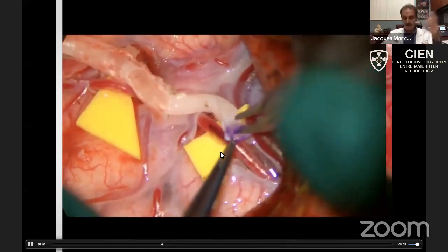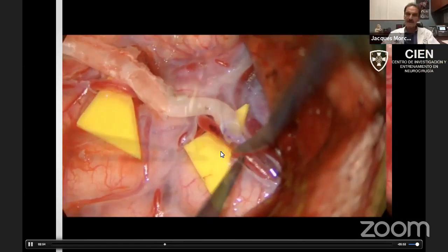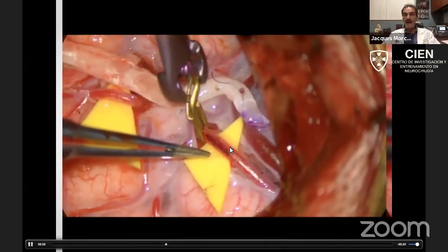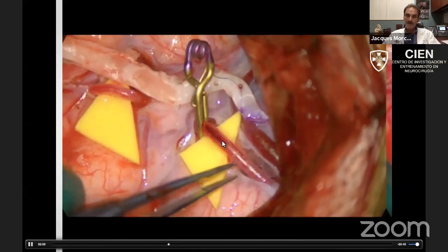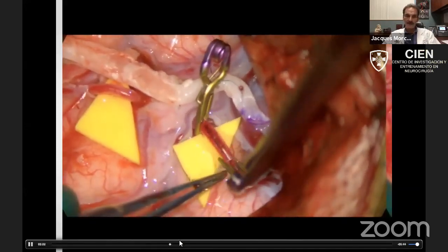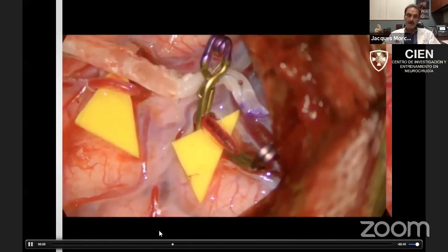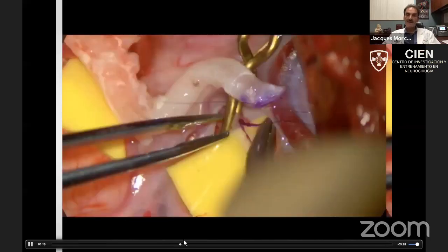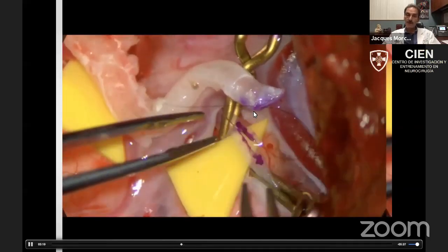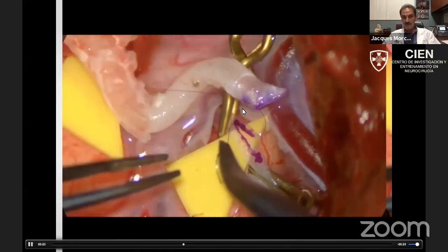We can talk a lot. I don't have too much time to talk about actual technique, but briefly, I only anchor the stitch I call it at 12 o'clock. You will see in a second, we're going to put temporary clipping. I'm going to use a disposable arteriotomy knife to cut it. And then we are going to color the edges, and you place the 12 o'clock stitch.